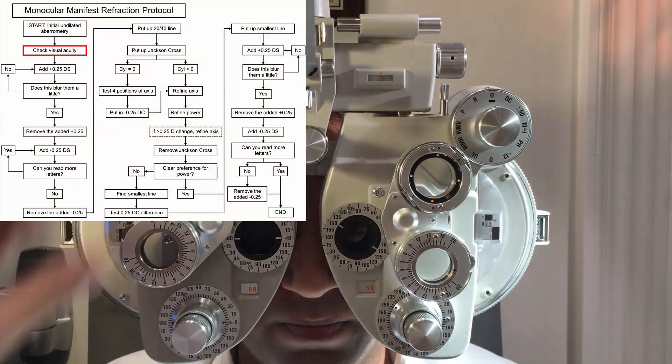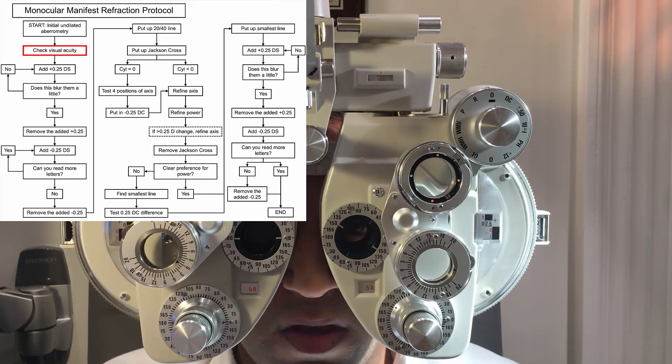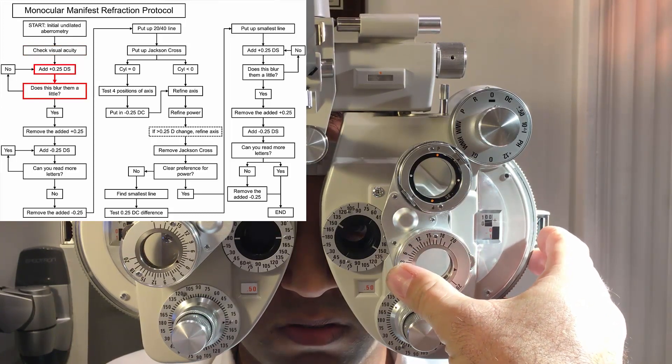I'm just going to go over here. This side, how far down can you see on that side? S, Z, R, D, N, H. That's about it, really.